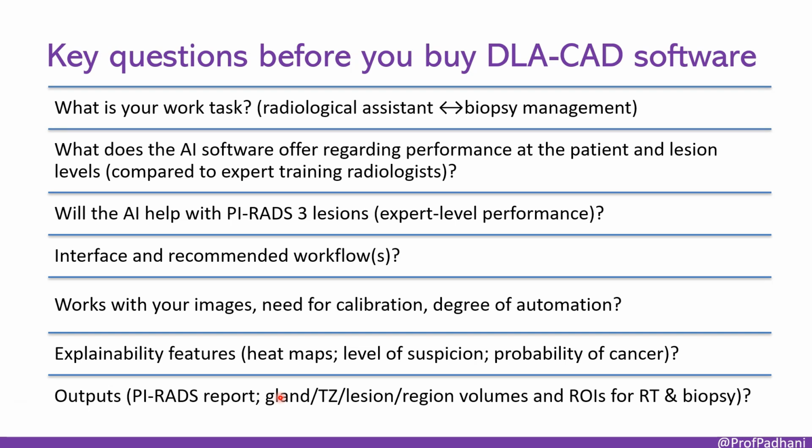What's the user interface actually like to use? And what workflows does the vendor recommend? Importantly, do those recommended workflows actually fit with how your department currently operates? Or will it require massive changes? Practicality check. Big time. Is the software compatible with your images, your MRI scanners, your protocols? Does it need special calibration? How automated is it versus how much user input is needed?